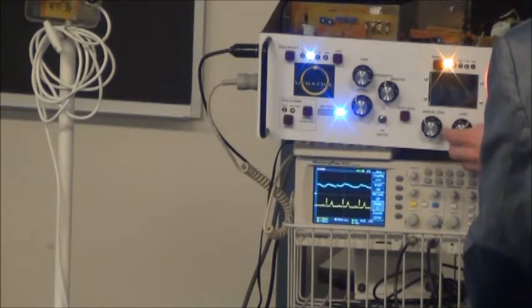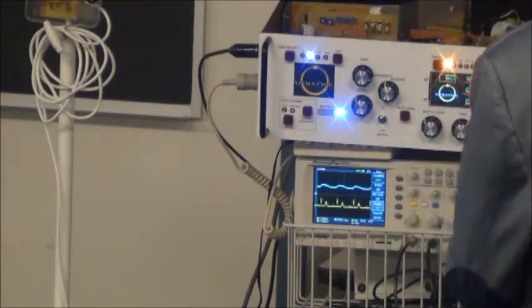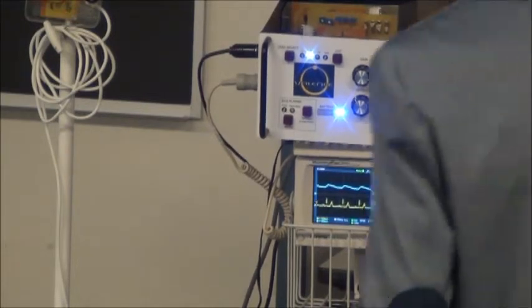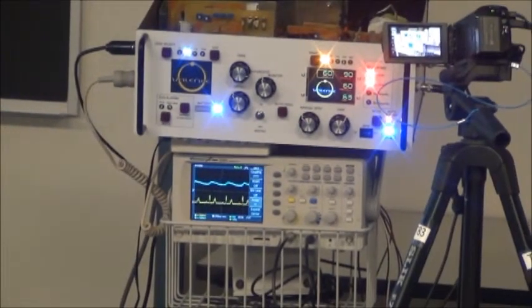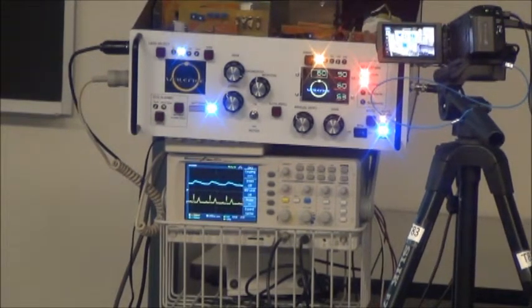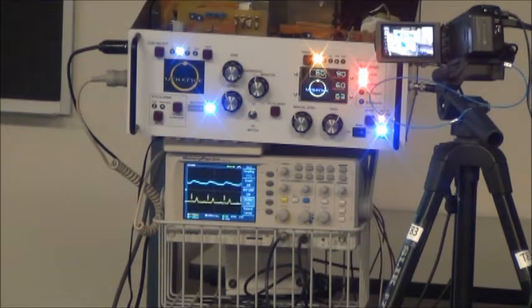In case the alarm is triggered, by pressing a mute button we can make the audible alarm silent for a 30-second duration. Even if the alarm is in mute condition, the LED will indicate which alarm is triggered. The reason we use a 30-second mute instead of a permanent mute switch is that the clinician has to acknowledge the critical patient situation and cannot ignore it or permanently disable the alarm.